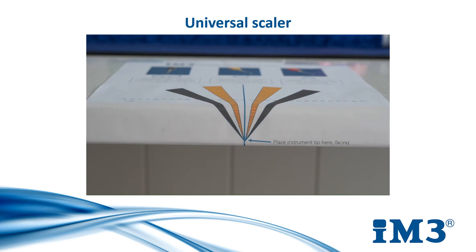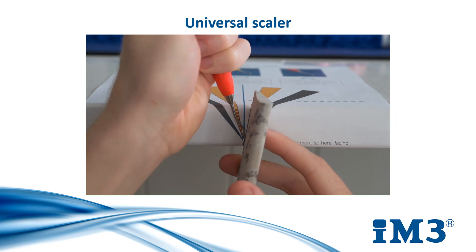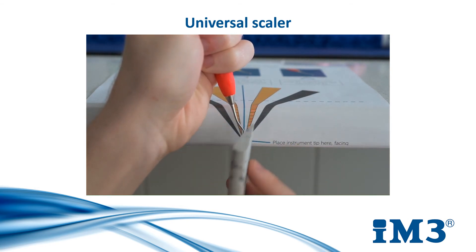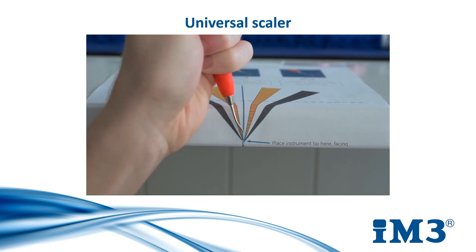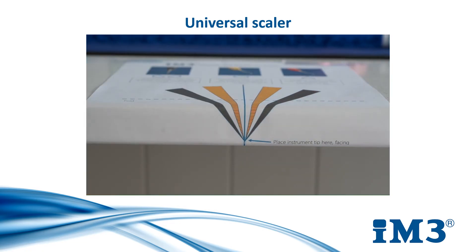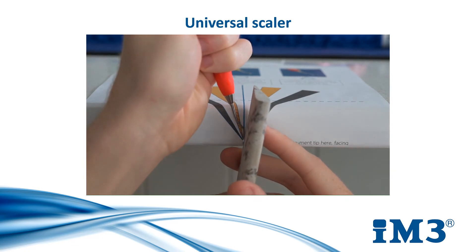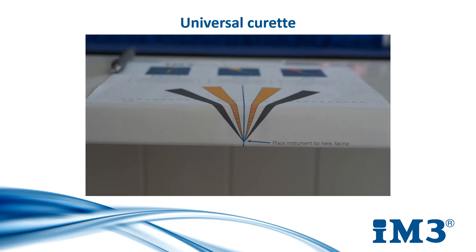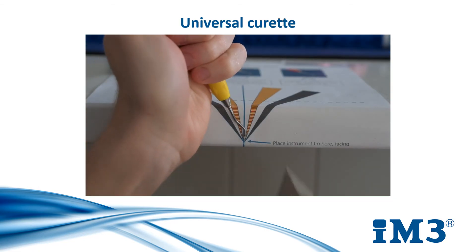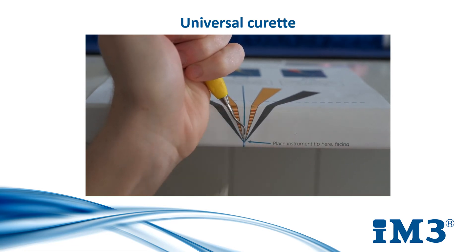When your instrument is in position, take a sharpening stone and place it at the respective angle. In this case, I am working with a universal scaler, so I will use the red and yellow marked zone. Move your stone in an up and down motion, starting at the back of the blade and working your way towards the tip. This sharpens the entire blade face evenly. As for the universal scaler, the universal curette has a 90-degree face, so it is sharpened by using the red and yellow marked zone also.